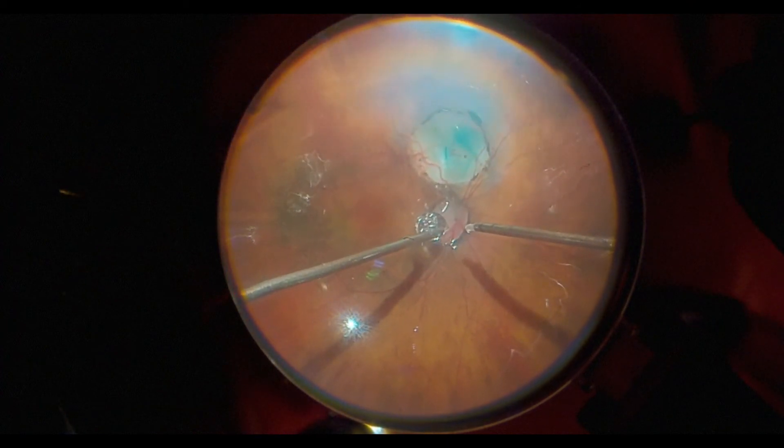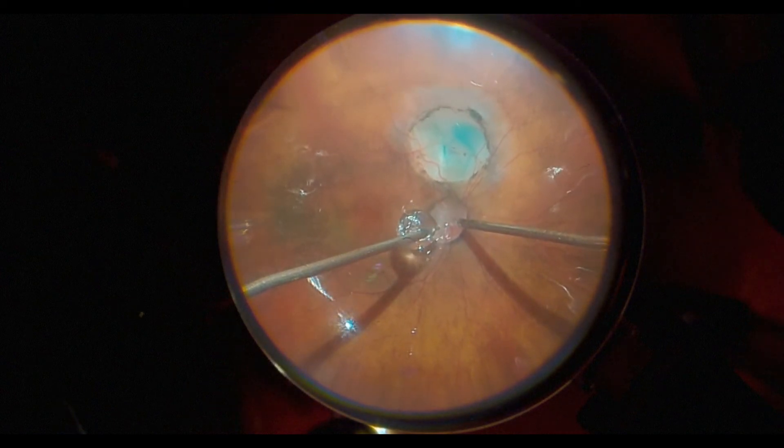So we use a very innovative technique that's been discussed before, where we put tissue glue inside of the optic disc pit.